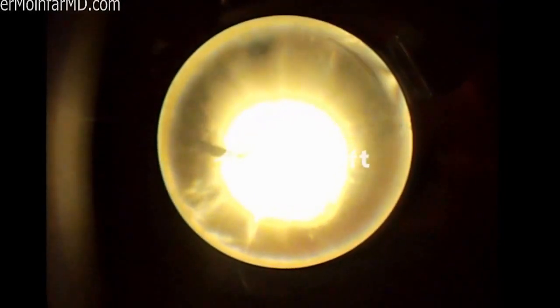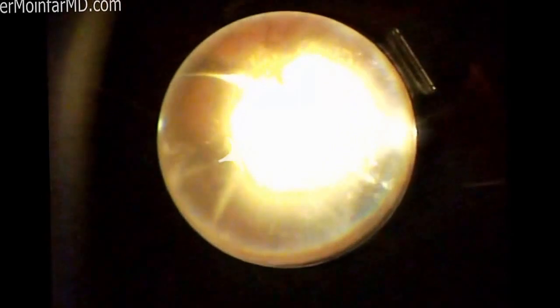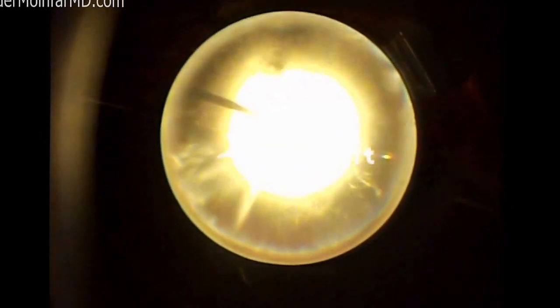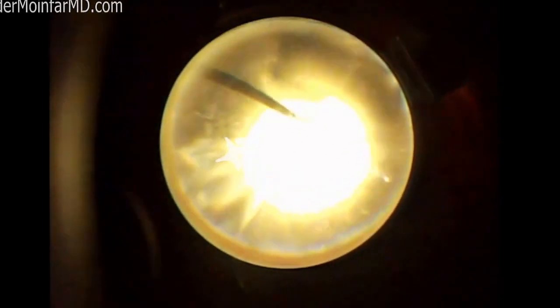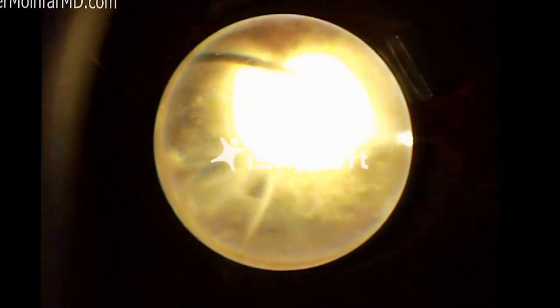So I just injected a white material inside the eye. There are different kinds of steroids that one can use. This one is called Triessence, and it's approved for aiding visualization during vitrectomy surgery. It basically sticks to the vitreous, so it allows me to better see what I would otherwise possibly miss, and it also allows me to complete the posterior vitreous detachment. Again, we don't want to leave anything behind. And once the posterior vitreous detachment has been induced, then the vitrectomy actually proceeds rather quickly.